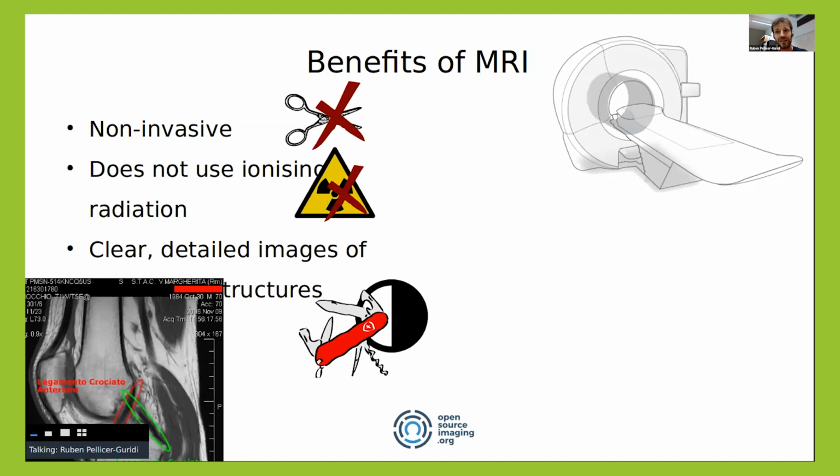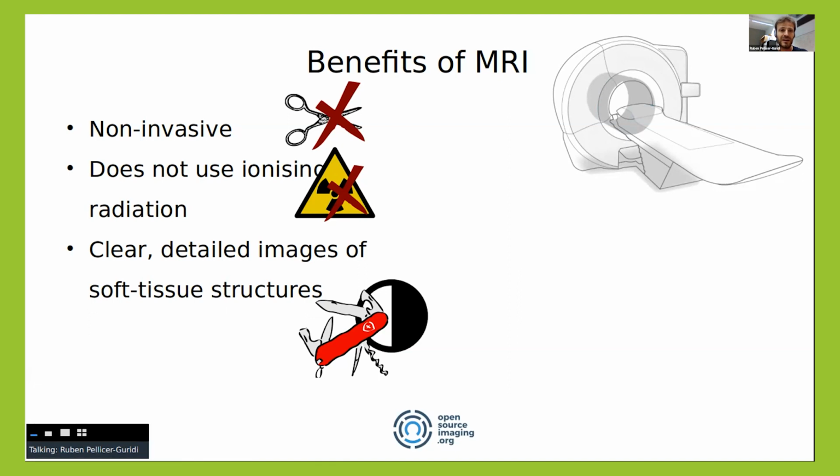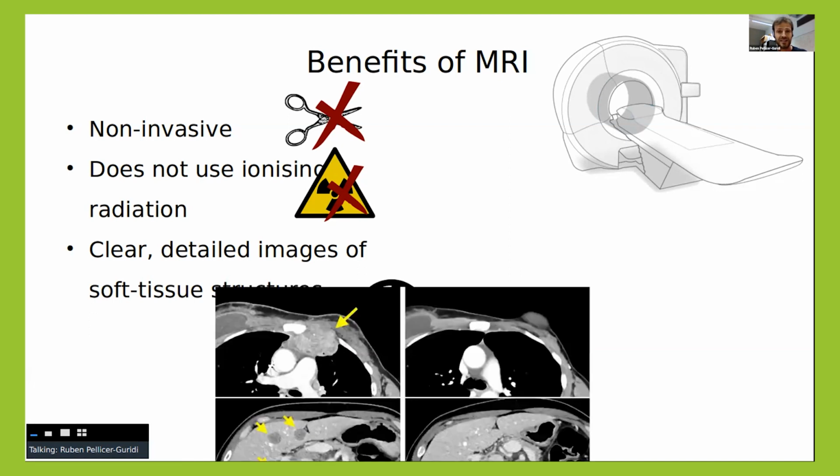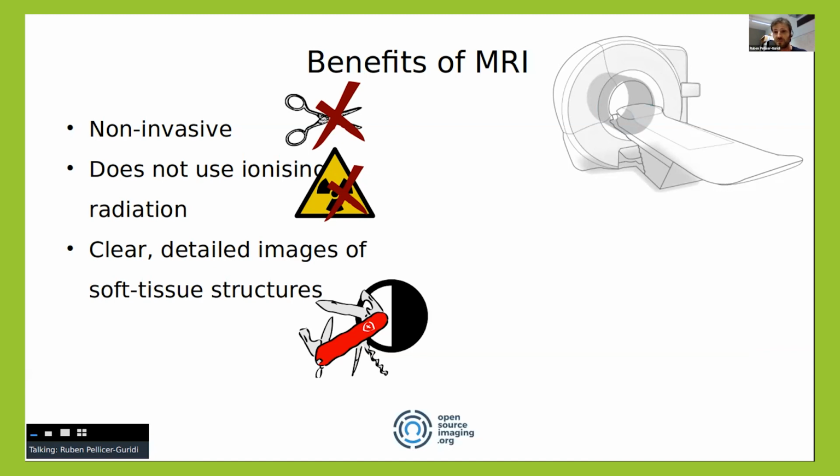And at the end, if they don't see it with any other technology, they end up referring you to an MRI to see it. But besides that imaging modality, you also probably know the spine, injuries like hernias, also tumors for the brain, for different parts of the body.